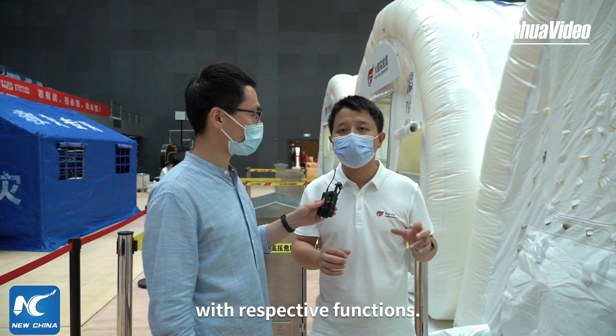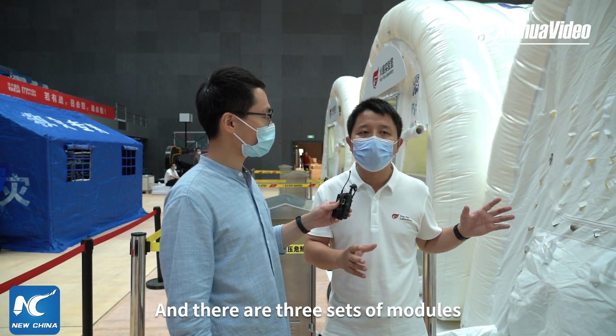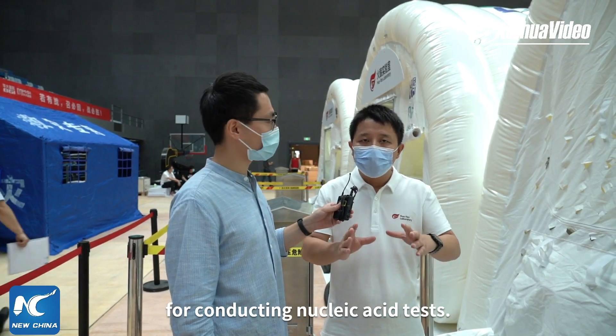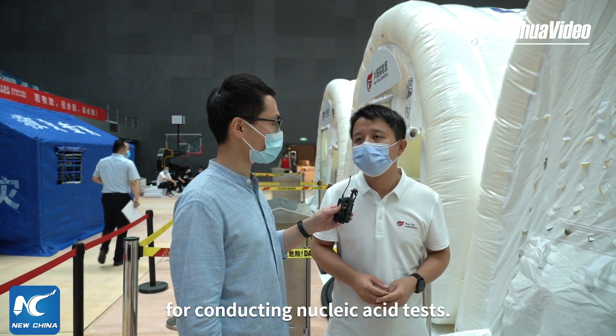基本上我们的实验室配置都是按照每三个功能分区组成一个实验室，然后同时在这里的话我们已经有三组这样的功能模块来分别开展我们核酸检测的工作。(Essentially, our lab configuration consists of every three functional zones forming one lab unit. Here we already have three such functional module groups to carry out our nucleic acid testing work.)